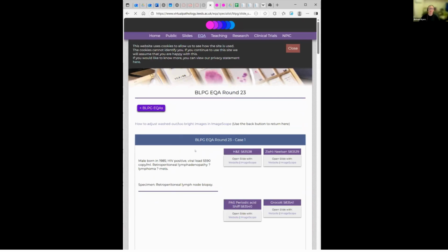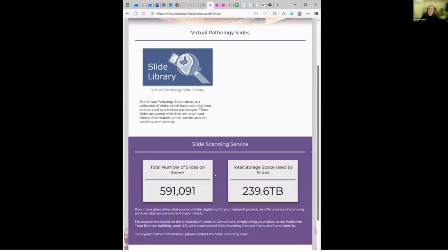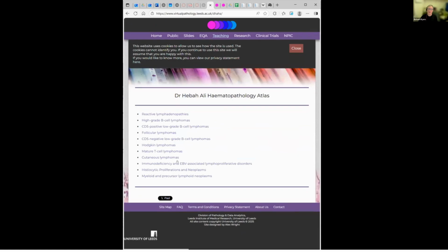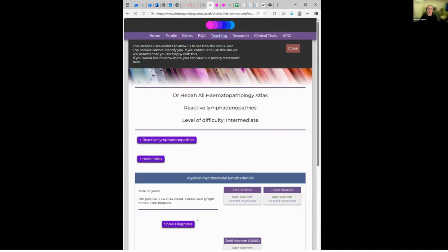So far, around 23. Also within this set, if you go to the slides, sorry, let me just find it. Teaching, yeah, teaching. And then the postgraduate sets, there is this set here, Dr. Heba Ali Haematopathology Atlas. This is relatively new within the EQA set, within the Leeds virtual platform. And there's a huge range of digital cases, and I will show some of these today, just to give you a flavor of this.